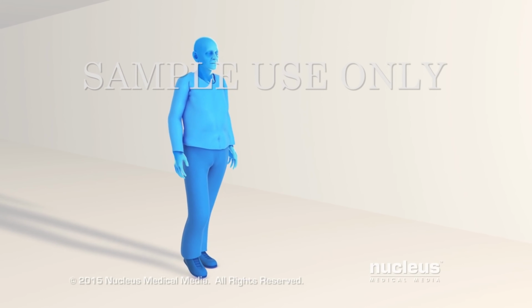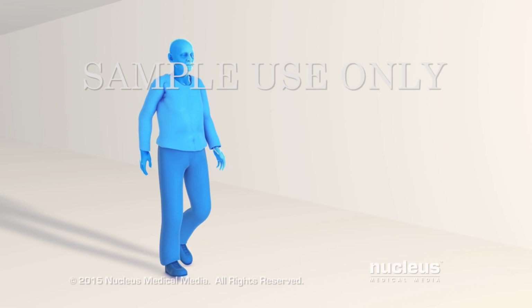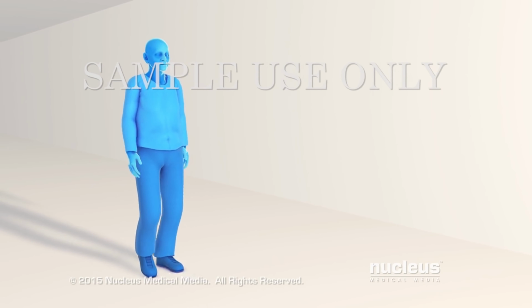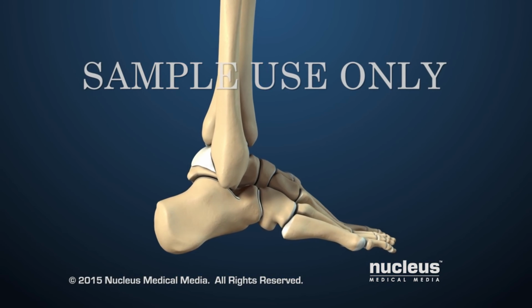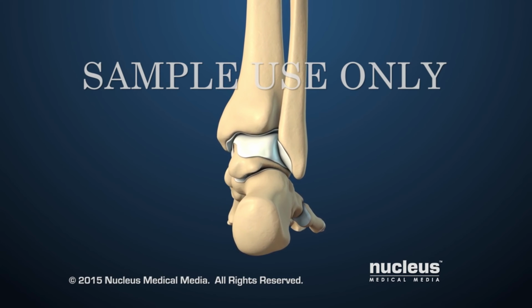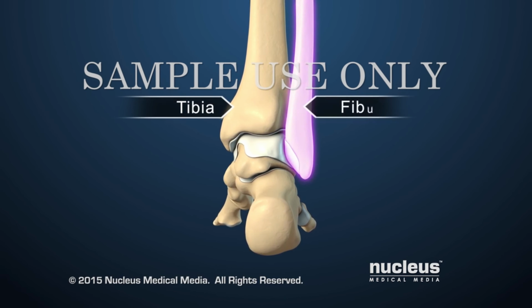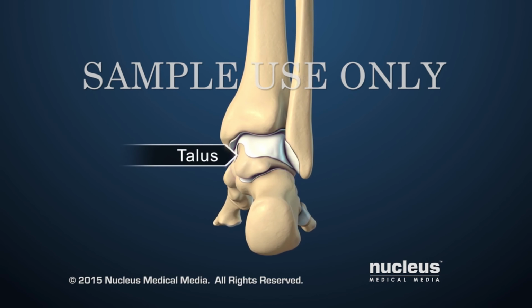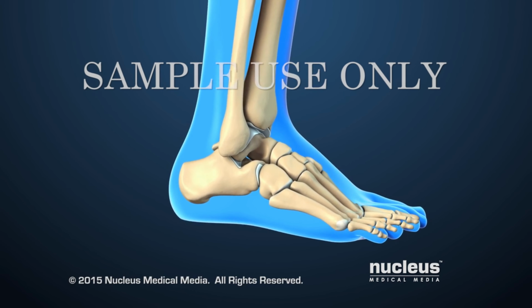If a person has severe arthritis of the ankle, a doctor may recommend a surgical procedure called ankle arthroplasty, or total ankle replacement. The ankle is the joint that connects the leg and the foot. The ankle joint includes the two lower leg bones, called the tibia and the fibula, and the ankle bone, called the talus. The joint allows the foot to move up and down.